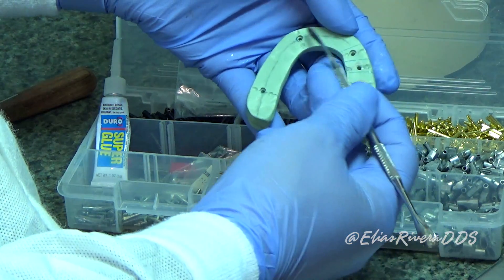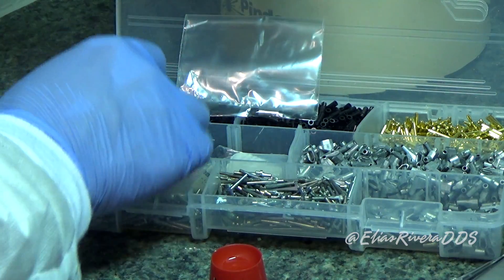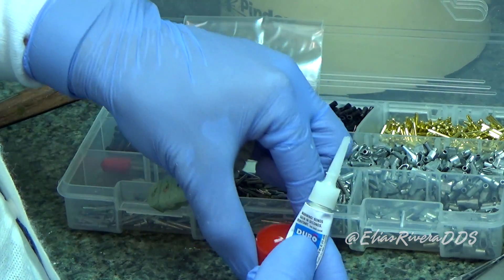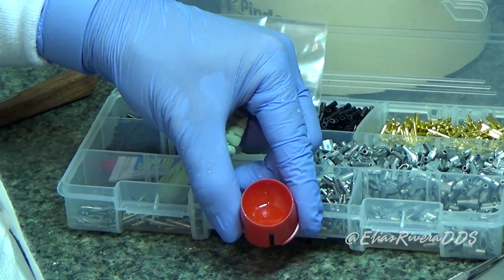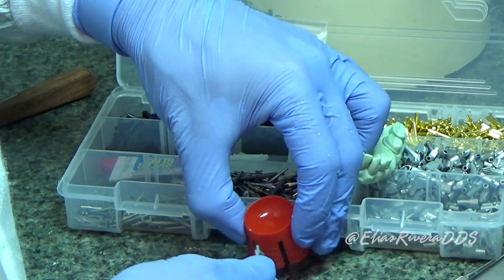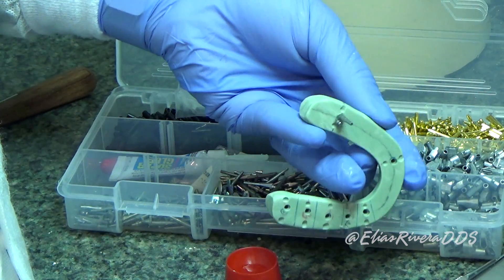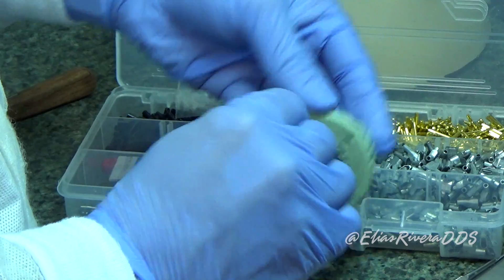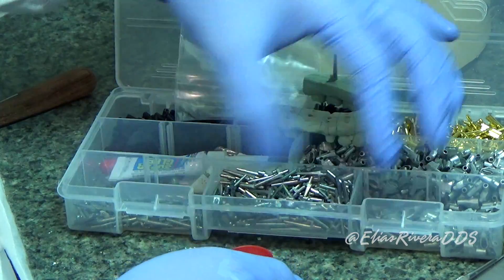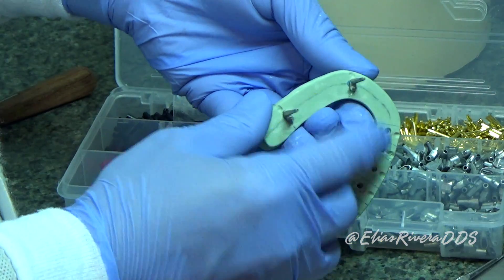Now we're ready to load our dowel pins using cyanoacrylate. We have created an anti-rotational feature using a round bur number 8. We're going to put a little bit of cyanoacrylate in the Dappen dish. Now we're going to pick up one of the dowel pins, dip it into the cyanoacrylate, and place it firmly. Please pay attention to the orientation of the dowel pins — you're going to have all of them in the same orientation, with the long ones on the buccal side. Make sure every single one has the long part on the buccal. Keep things organized.